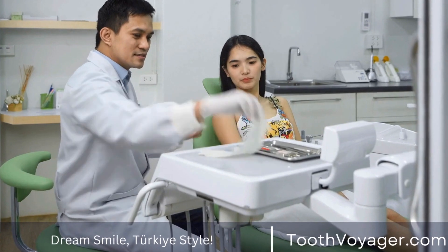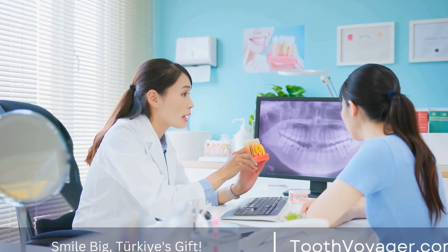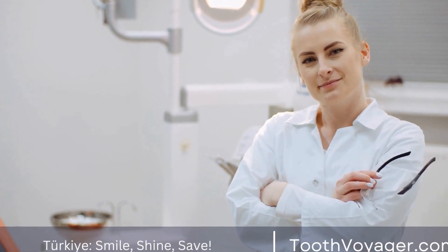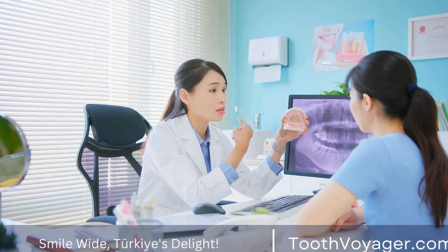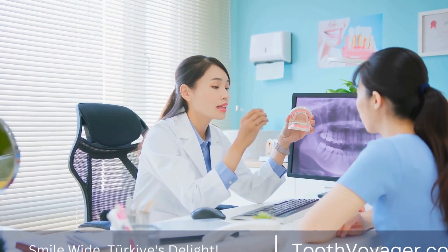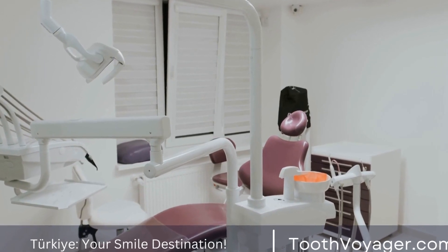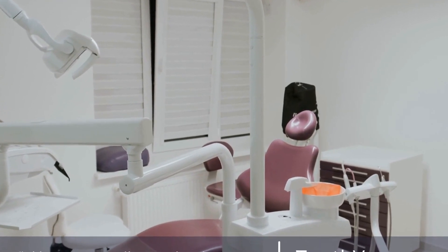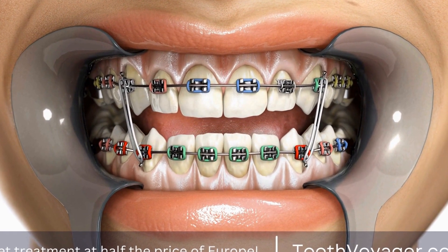Digital Imaging. One of the most significant advancements in digital dentistry is digital imaging. Traditional dental x-rays have been replaced by digital radiography, which offers numerous benefits. Digital images can be captured quickly and with less radiation exposure to the patient. Furthermore, the images can be manipulated and enhanced to provide a clearer picture of the patient's oral health, allowing dentists to diagnose issues more accurately and effectively plan treatment.